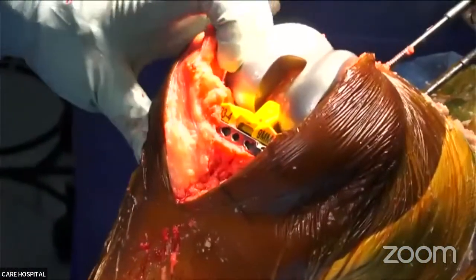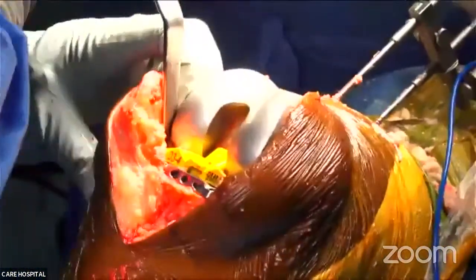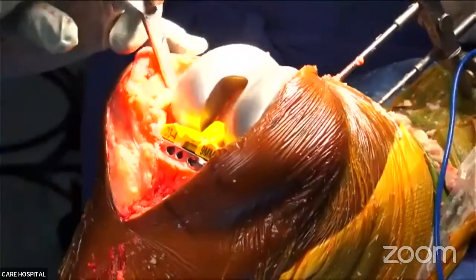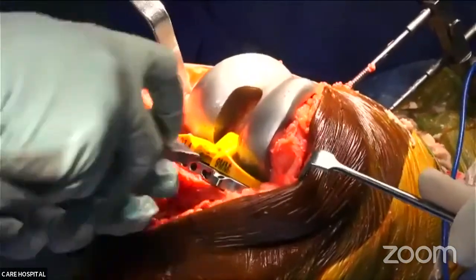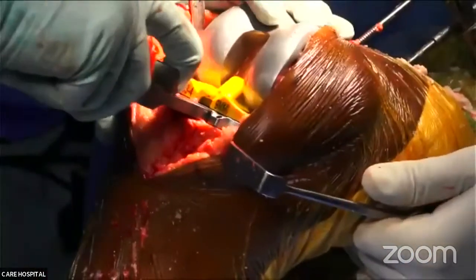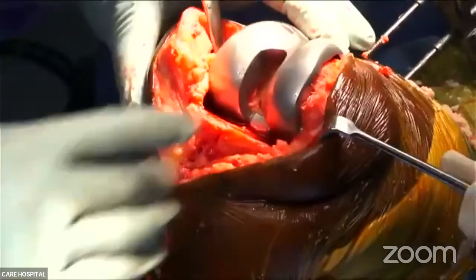Hold it. Tibial handle. Stem. Femur extractor.